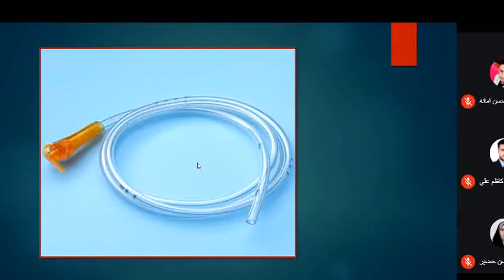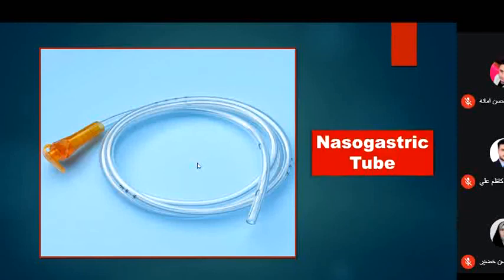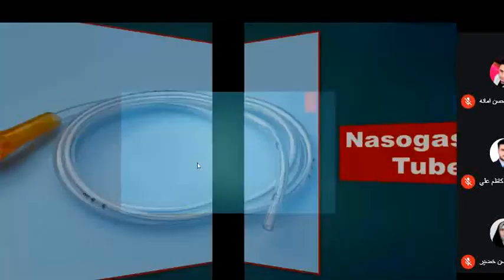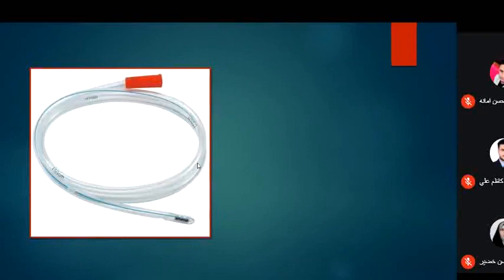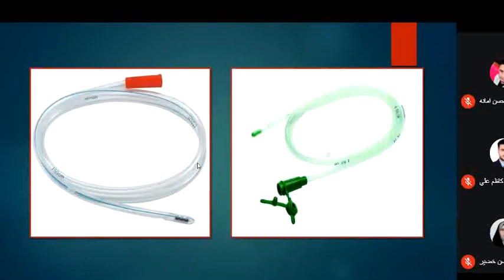Now we are talking about an instrument used in neonatology, in emergency, and even in internal medicine and surgery, widely used, which is the nasogastric tube. We have different sizes and shapes for the nasogastric tube.